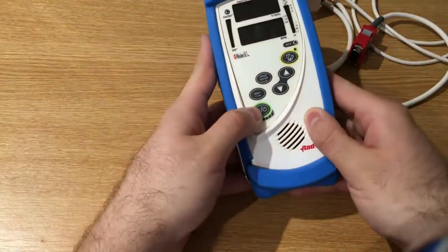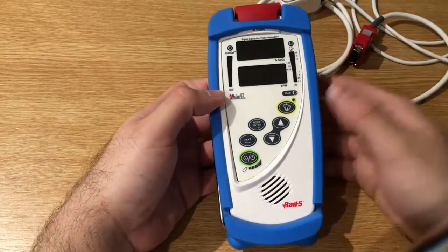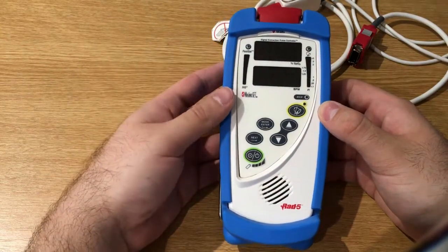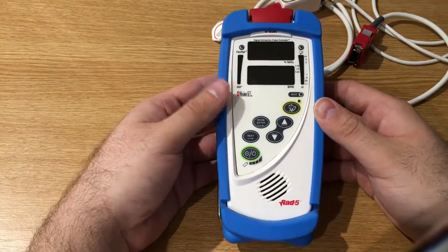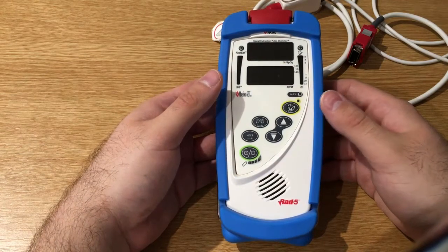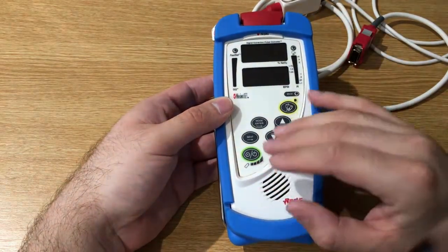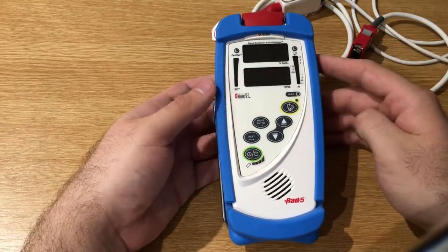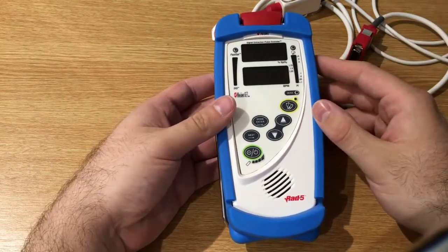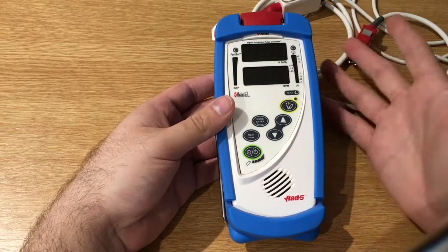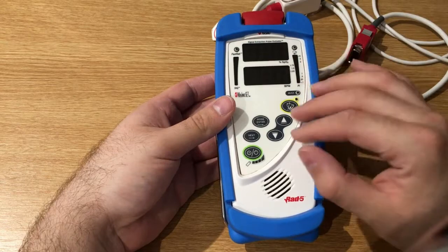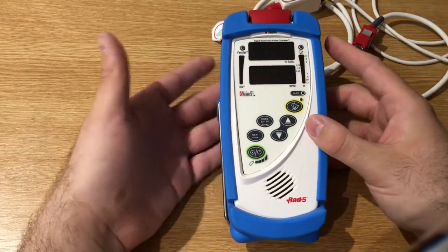Obviously the Radical 7 has a much more easier and intuitive interface. This doesn't have the gorgeous touch screen that the Radical 7 has.